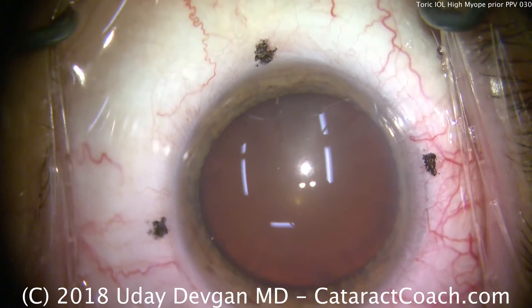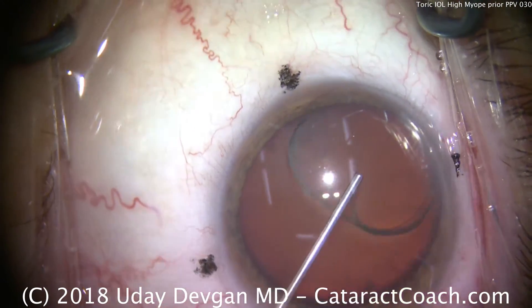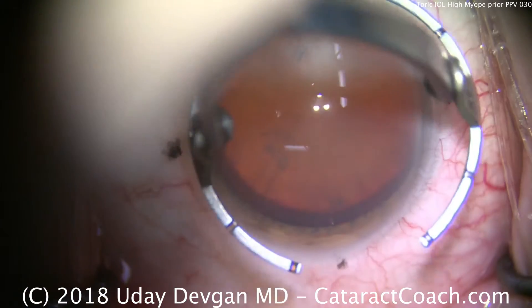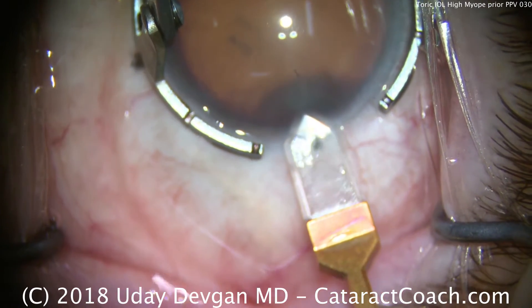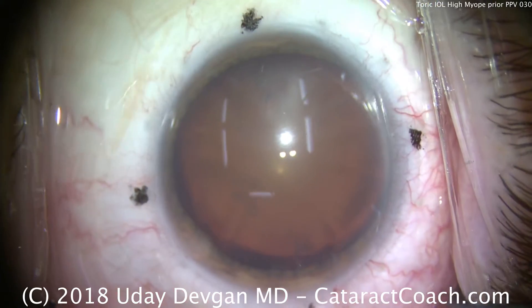A paracentesis is made and the eye is going to be filled with anesthetic and then viscoelastic. Now, this is an unusual eye — it's had a prior pars plana vitrectomy for a rhegmatogenous retinal detachment due to the patient's high myopia. There is the diamond keratome being used to make the phacoincision.